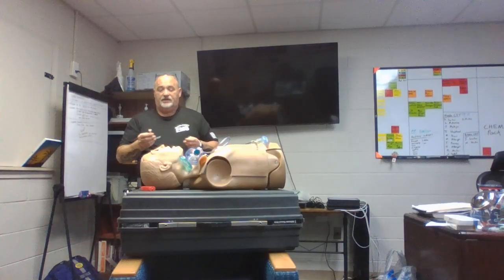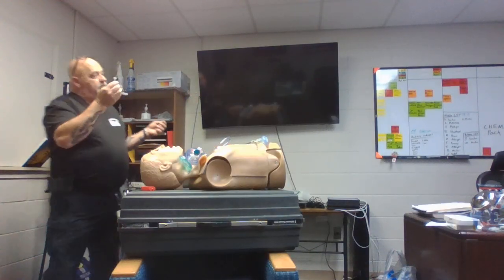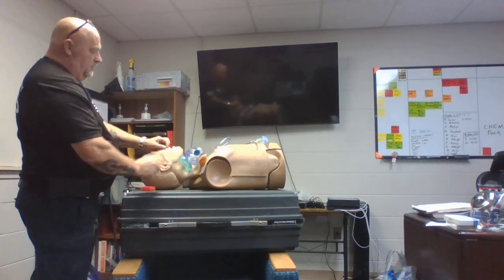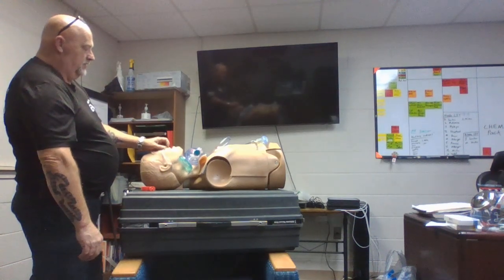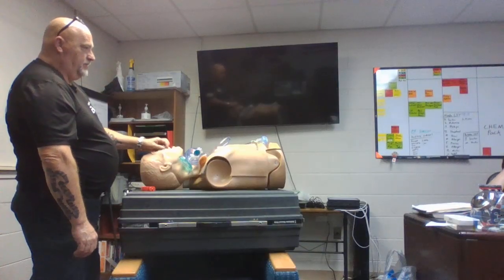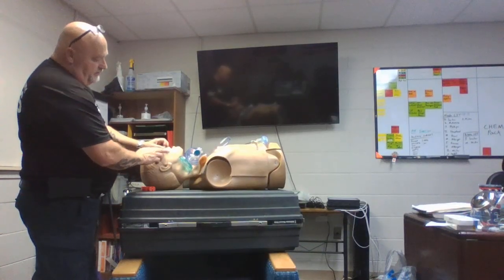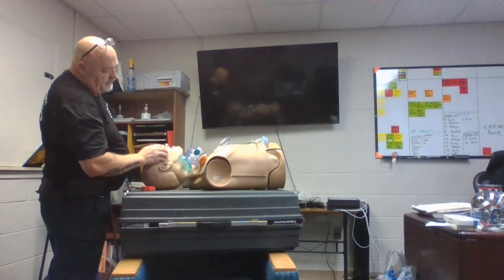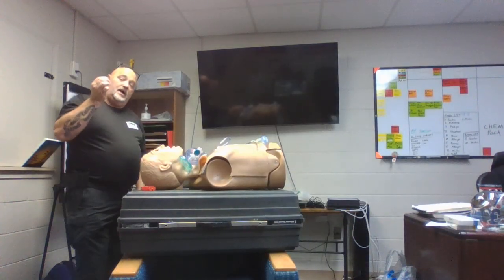Okay. We measure these. Justin, how do we measure these? Corner of the nose to the ear. From the nose to the ear. The base of the ear. Yeah. Would you look at that? That's supposed to be the right size.